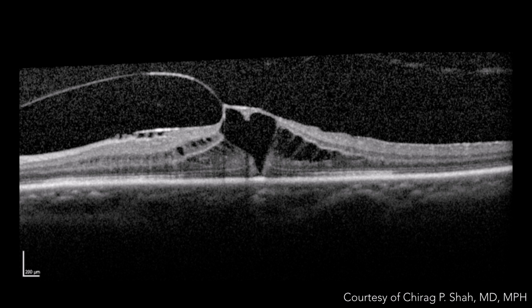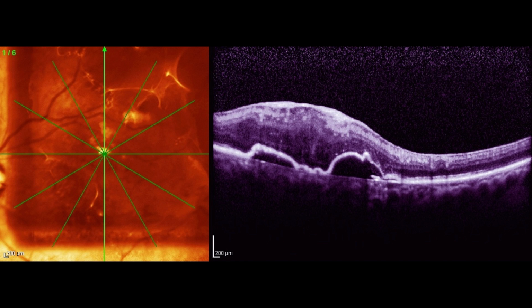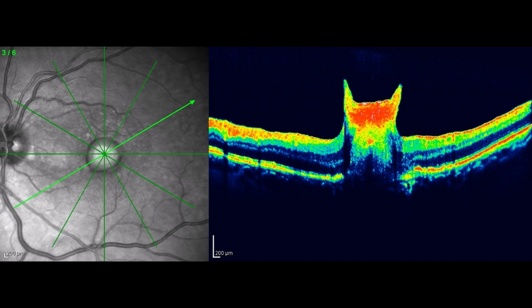This is from Trogshaw, one of my co-fellows. This patient actually came in on Valentine's Day with heart-shaped VMT. Yeah. There's a happy ending too. And this is the you dirty old rat sign, a patient with a nice little PED there. This is the bat sign. That's actually post-op. That's actually a good outcome. I saw him yesterday. His vision improved. He had this big plaque of pre-retinal fibrosis from a subretinal hemorrhage that had gone through a potential macular hole. So this is kind of the best we could do for him because that had happened a while back.